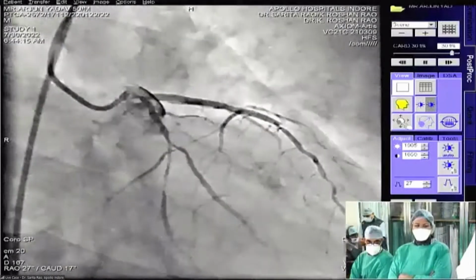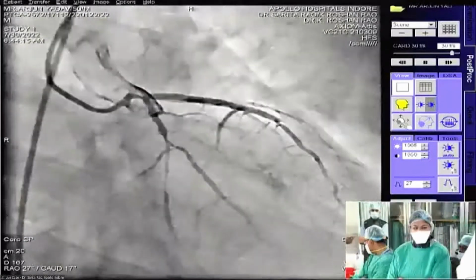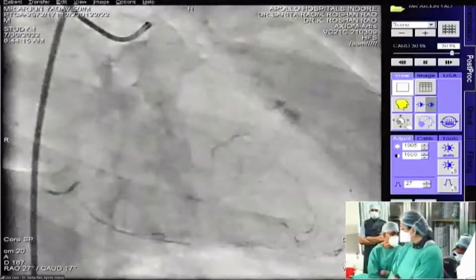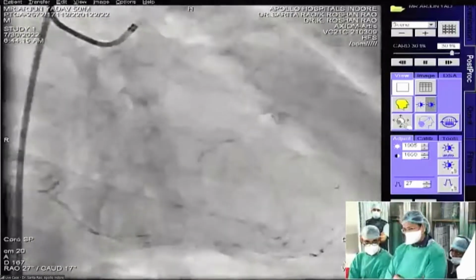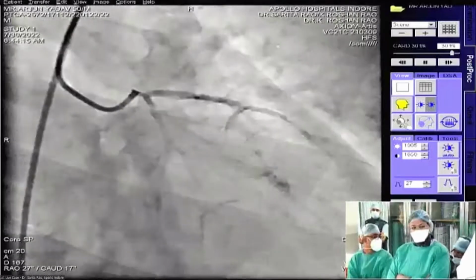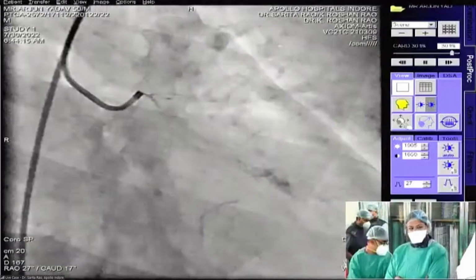Any other comments? Yeah, it's on. And some sort of circulatory support, definitely, even with an EF of 25 to 30%. If not Impella, at least IABP to go ahead, because there is a left main lesion which needs to be tackled. You said IABP? Yeah. At least IABP, some sort of mechanical circulatory support, yes.